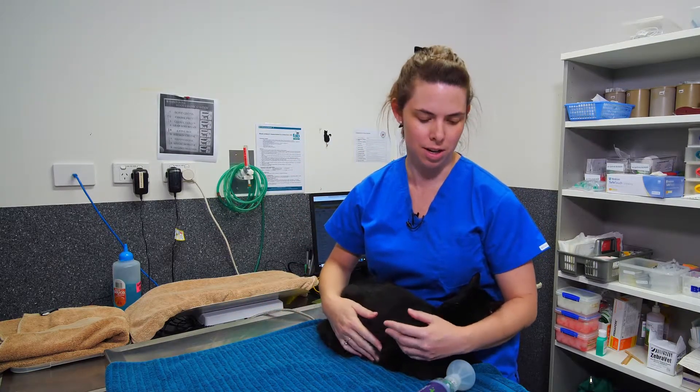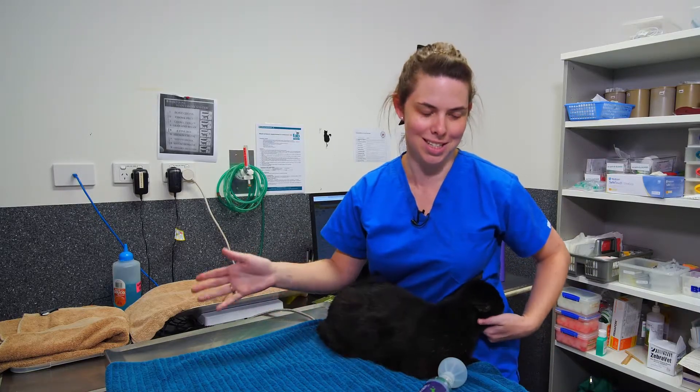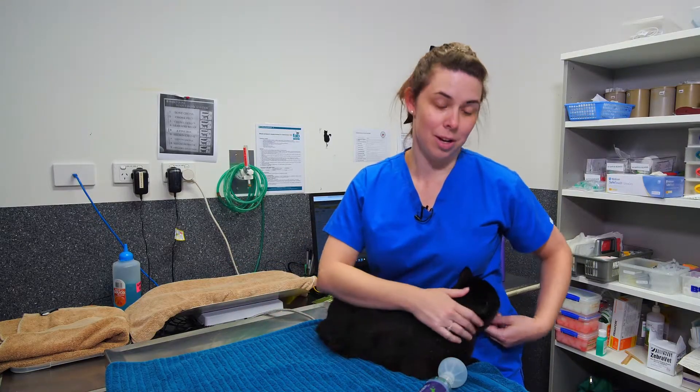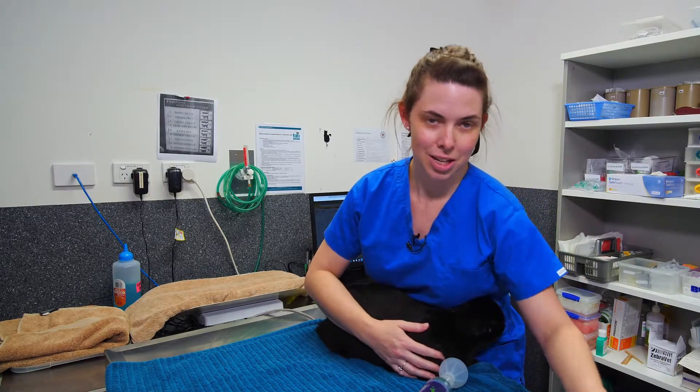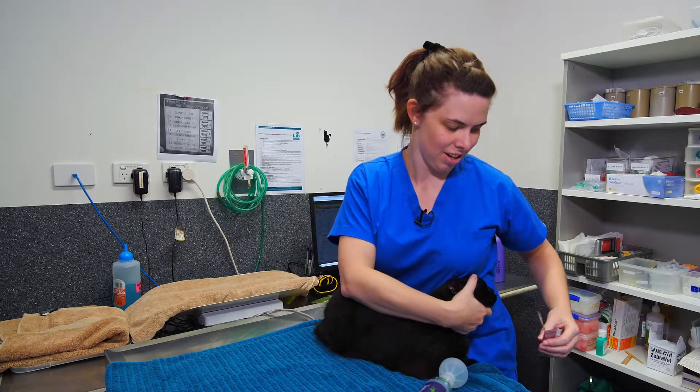After the second puff, allow another five to ten breaths. If it's just one puff, you only need to do one with five to ten breaths. Cats generally like treats, so afterwards you can offer them a nice tasty treat to make them happy.